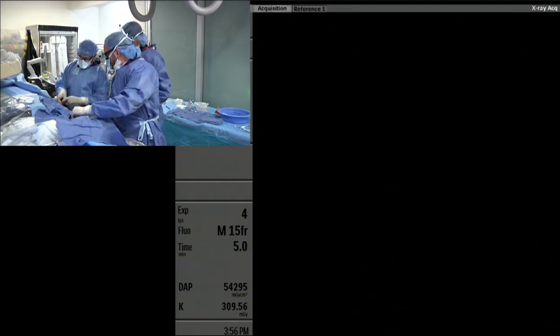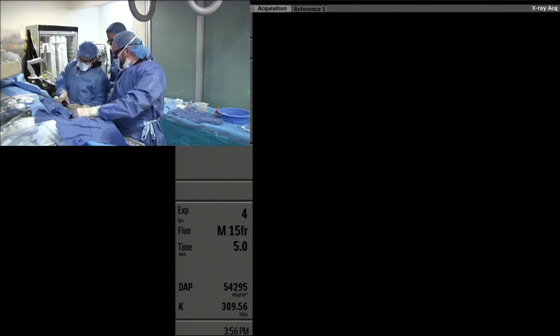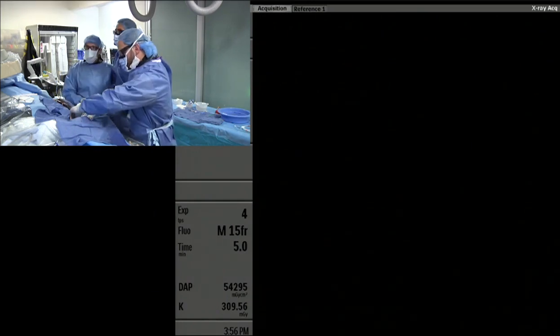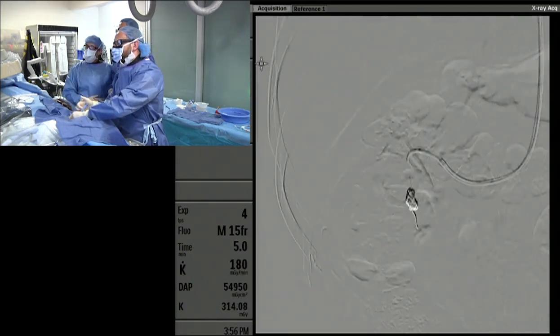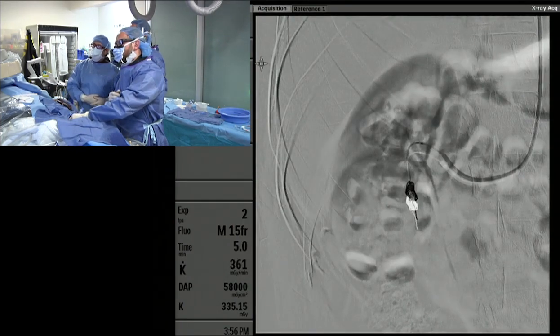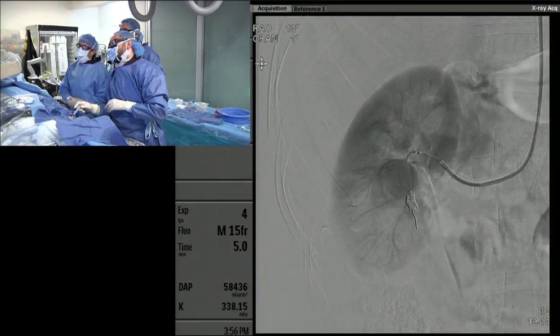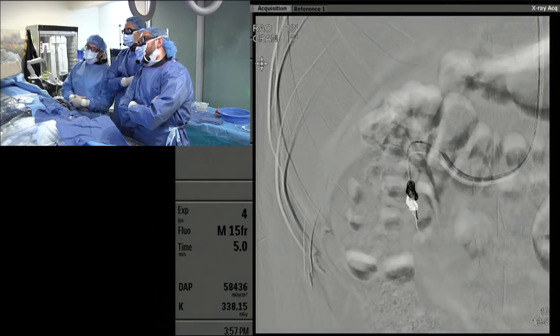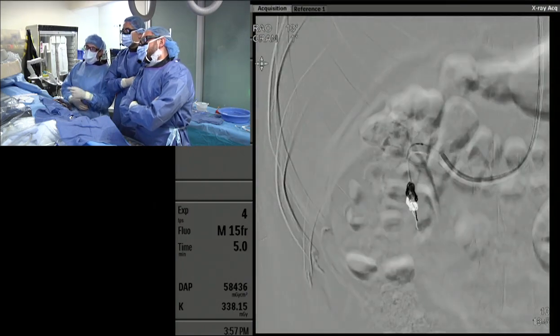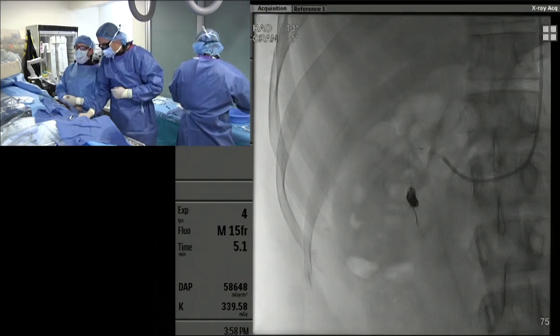Yeah, I mean, in a sense, I would treat this like a pulmonary AVM. Exactly. Where I want to be as close in the arterial feeder, as close to the sac as possible, but making sure that I had some kind of scaffold that wasn't going to fly through the sac, whether that's a coil or, as you said, I think you said you had a 2.8, and a plug would work just as well. Yep. We don't have to deploy this coil here, but I think we probably can, and then maybe try to cannulate. We'll finish this branch and maybe try to cannulate that other branch to follow. I like that idea, actually.